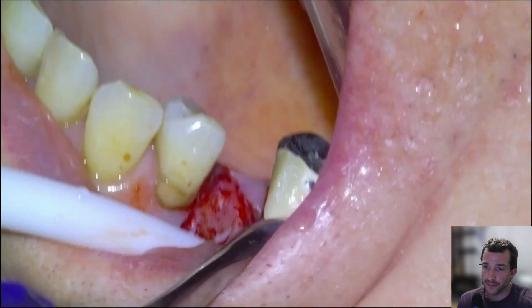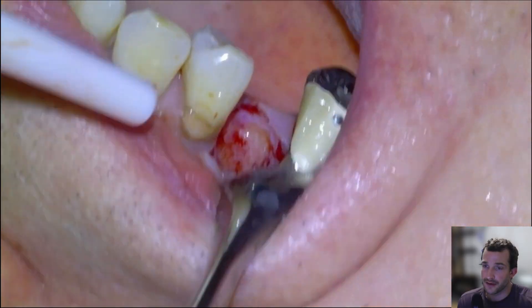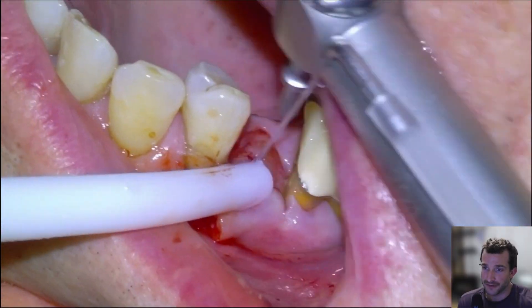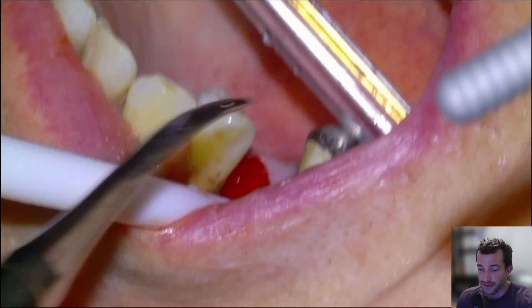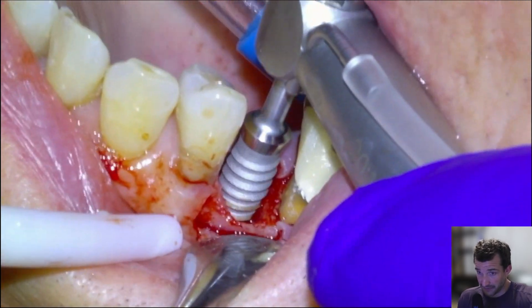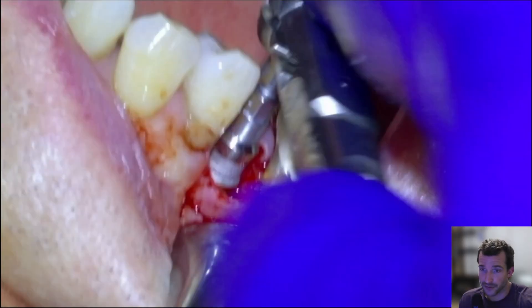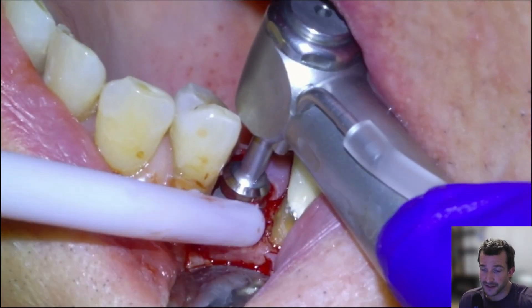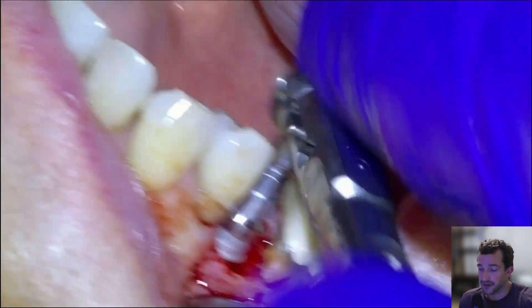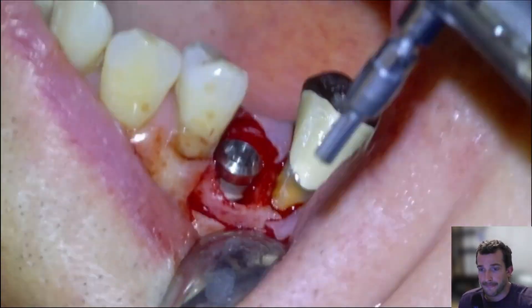We'll open it up to a 4.5 and profile the bone with the profiler — nice conical shape there. This is going to be our last burr, the 4.5, going down to about 10 or 12 millimeters. Irrigate thoroughly with saline before we take our implant and screw it in. It looks like a 4.8 by 12 millimeter tissue level implant. Once the implant motor torques out — I usually set it to torque out at about 50 newton centimeters — we'll take our torque wrench and finish screwing it into the socket to our desired height.